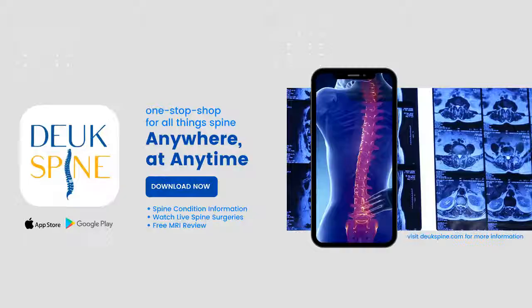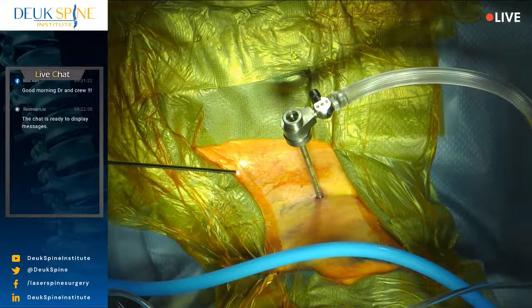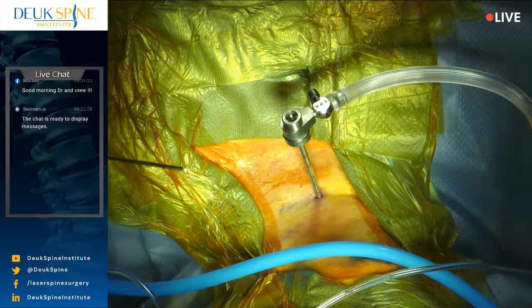You were able to learn a little bit watching the animation video, but basically we're going to be using a laser to remove the herniated disc in the back of this disc, C5-6. So this is a C5-6 disc herniation. There's some calcification of the disc. And we're going basically to leave the entire C5 disc alone, except for the little herniation in the back we're going to remove with the laser. And we're going to debride the annular tear so that it'll heal properly.